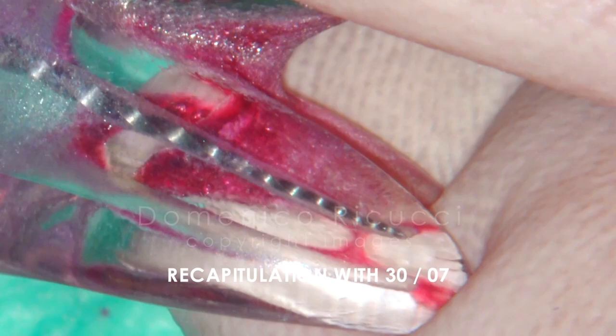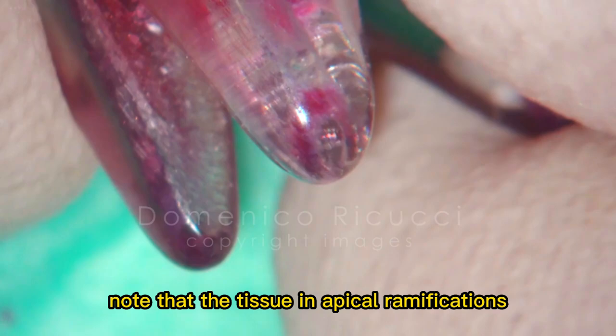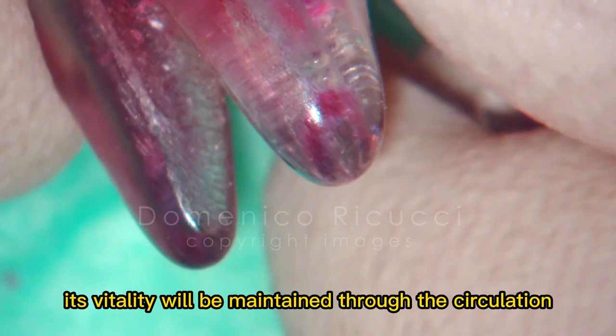Final preparation of the apical collar. Note that the tissue in apical ramifications is undisturbed. Its vitality will be maintained through the circulation originating from the periodontal ligament.